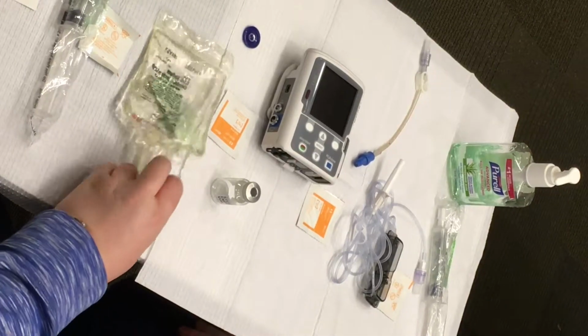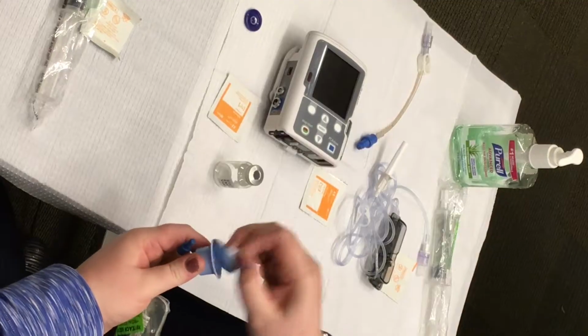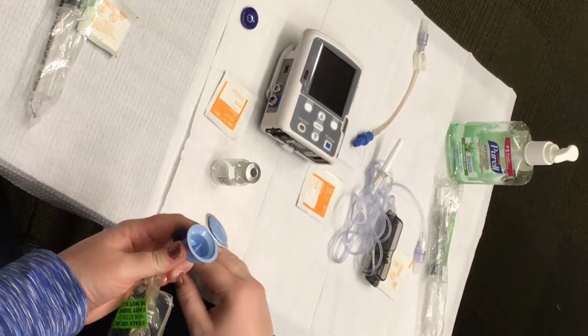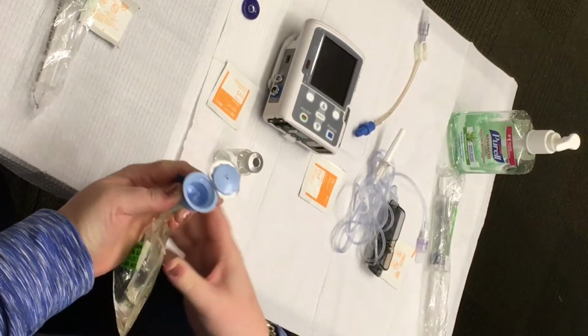Peel the foil cover off of the blue adapter of the mini bag. Inspect the inside of the adapter for any visible moisture. Discard the bag and get another if any moisture is noted.